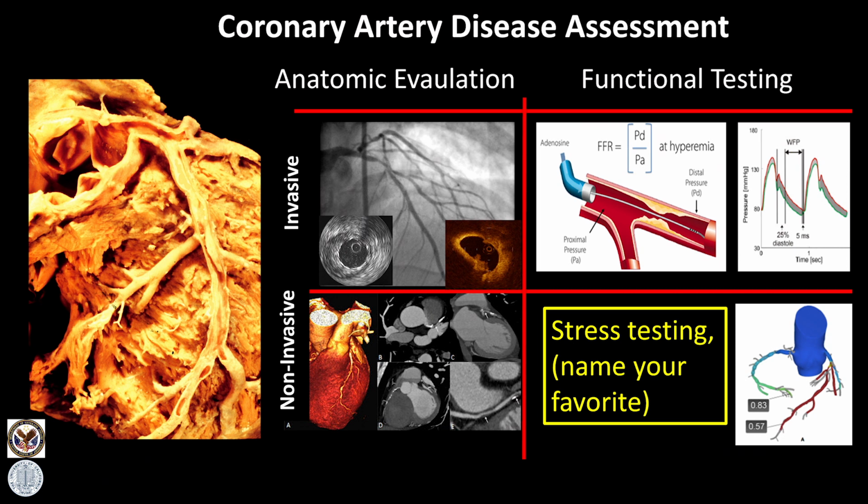Please recall that the pressure is transmitted in a coronary artery completely normally without any pressure loss in the absence of atherosclerosis. Thus, the ratio of pressure from distal to proximal, or from the coronary artery to the aorta, should be 1 if there are no obstructions. Thus, we can determine, based on some simple principles, that the loss of pressure across the stenosis reflects the loss of flow due to the increasing resistance. We'll talk more about that in just a moment.